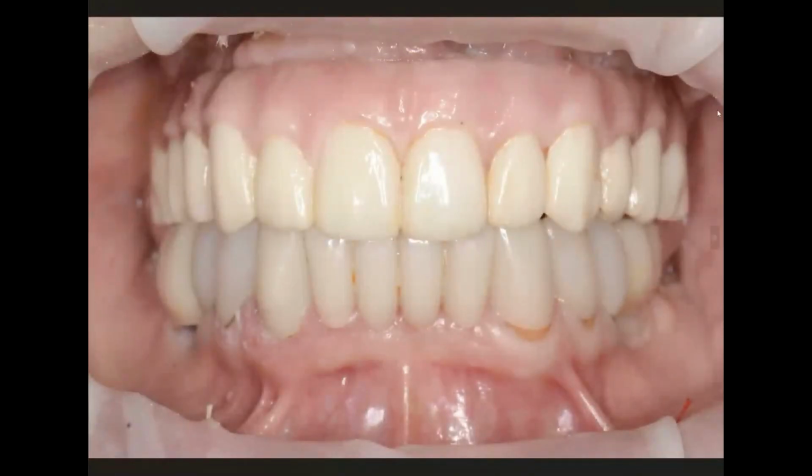Okay. So here we have a case. All right. This is a patient of mine, been in my practice since the beginning, 24 years. And about 14, 15 years ago, I did his upper arch. This is an upper bridge. It is an implant level bridge, full arch restoration. Been there for 14, I think, going on 15 years. And he came to me needing to replace his bottom teeth.